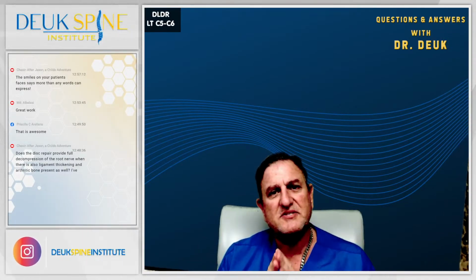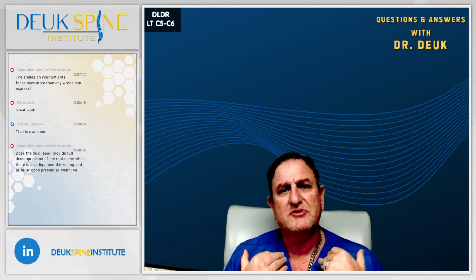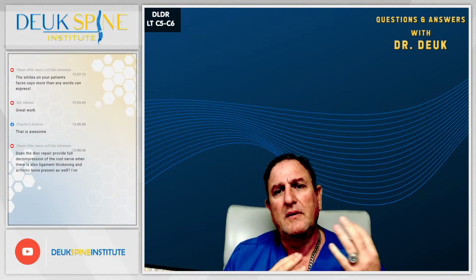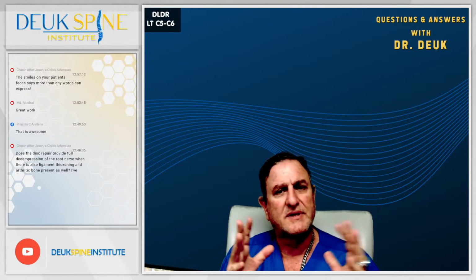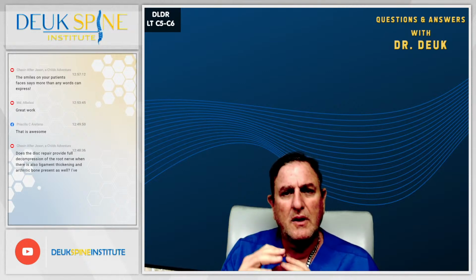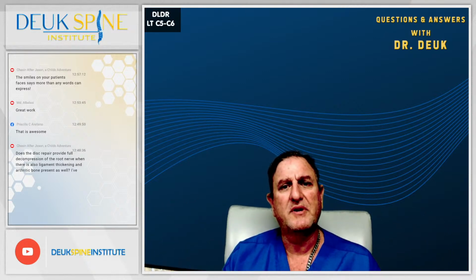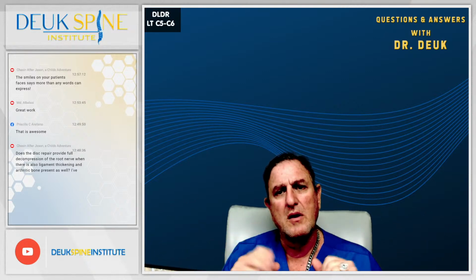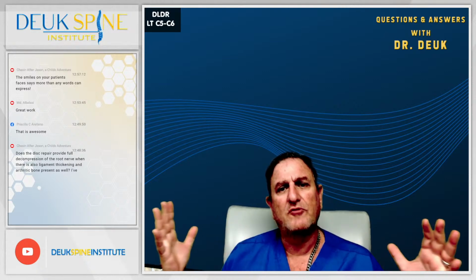Wow, what a great testimonial and what an amazing case. So this young man that just had surgery we've just completed, he injured his spine and his neck through trauma. He's had pain for a long time, and we looked at his MRI. We just saw a small C5-C6 tear and bulge. And it turns out the number 5-6 disc is the most common to be injured, most common to cause problems, by far. So we were looking at it and I realized that's got to be the cause of his pain.